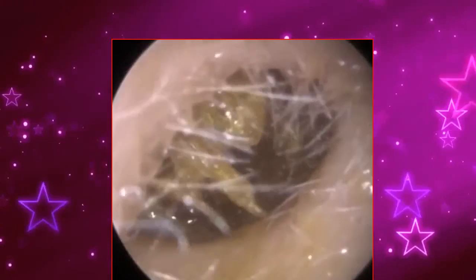It's more white and light yellow. More to the centre, to the core of this skin plug, the skin has oxidised, it's died, it's been there longer, so it's turning more of a darker brown shade. At this stage, the endoscope's not actually in the ear, it's just hovering at the entrance. I'm resting it against the tragus, and I've just got a fantastic view.